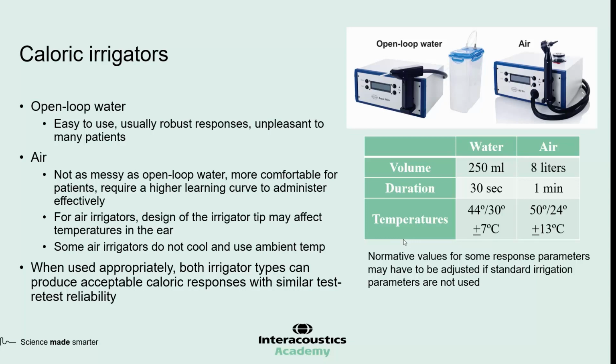Open loop water, technically for the examiner, it's very easy to do. You just basically put the water in the ear and you get the response. You usually get robust responses, which means you're getting strong stimulation, and usually the patient has strong responses. But for that reason, most patients find water irrigations unpleasant.